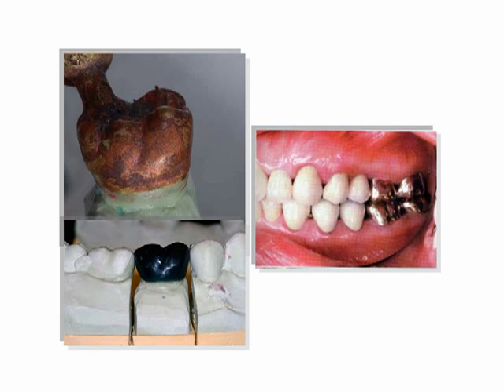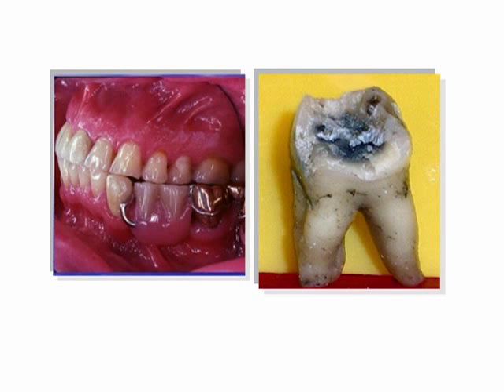Indications for the complete cast restoration include extensive loss of coronal tooth structure, whenever axial or occlusal contours cannot be corrected with a more conservative restoration, and in general, most endodontically treated posterior teeth. Contraindications include situations in which a more conservative restoration is possible, or in situations where a high aesthetic need exists.